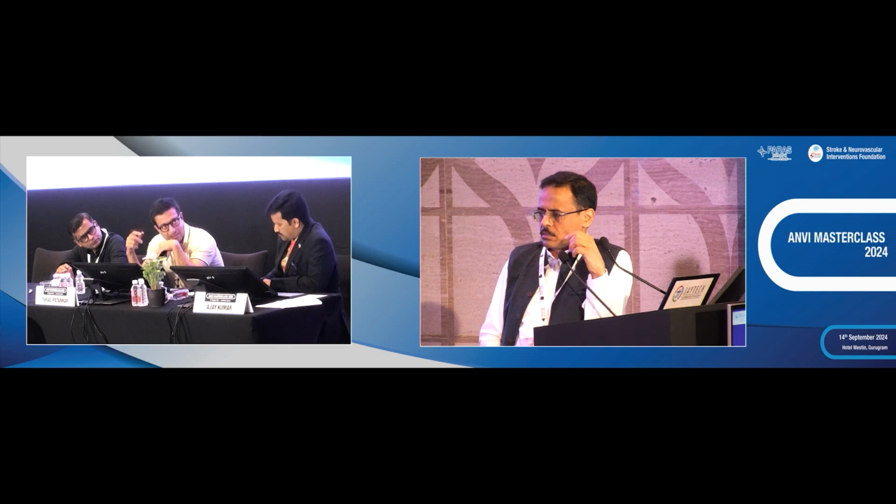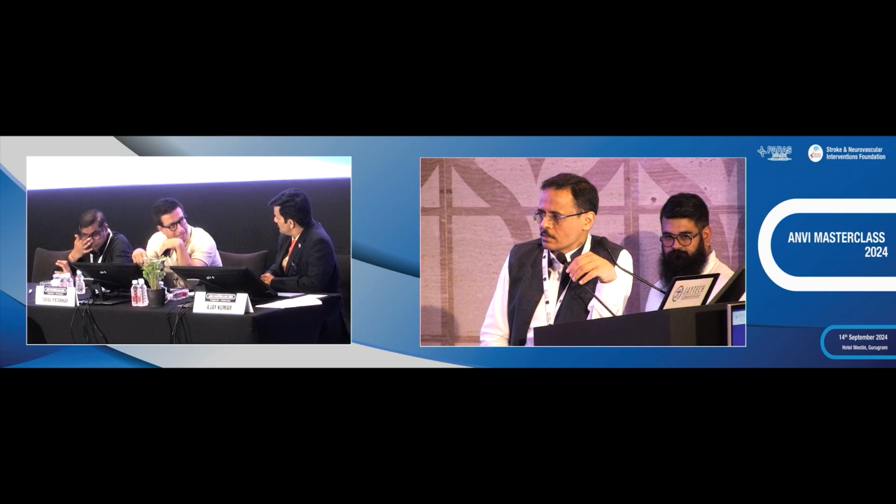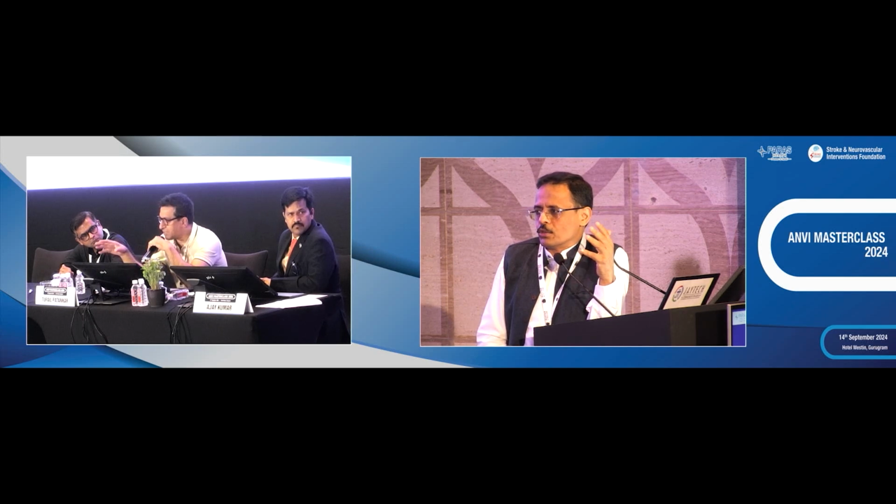And then I said, yeah, put a stent in, which is when I should have realized that there is underlying ICAD, which I did not realize. And then as soon as the stent was pulled, boom. There was a rupture on table. So, I don't know. We don't do that many thrombectomies.